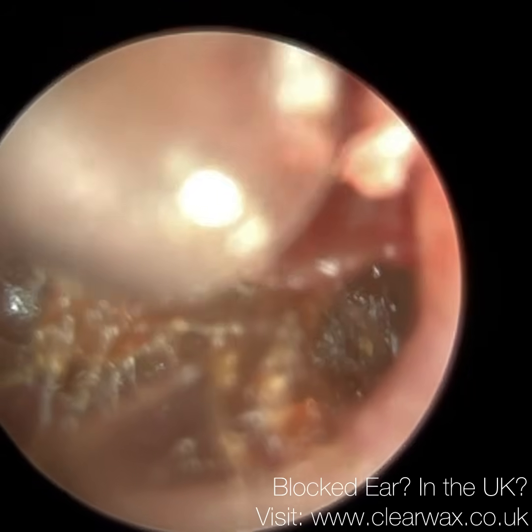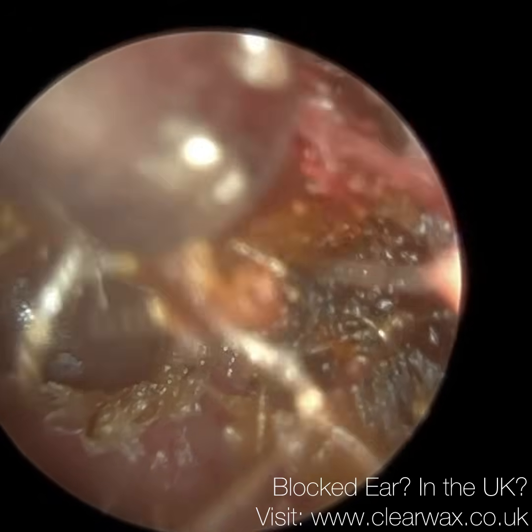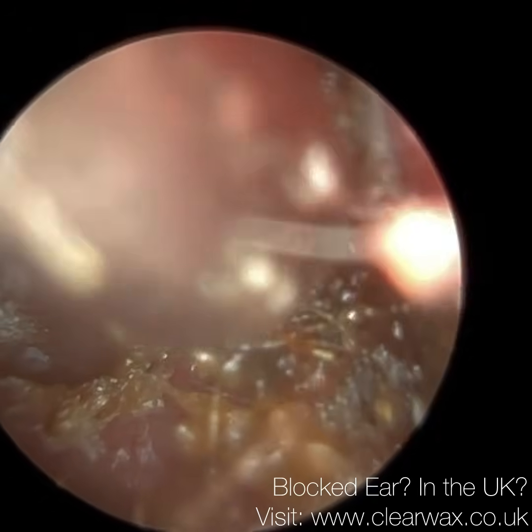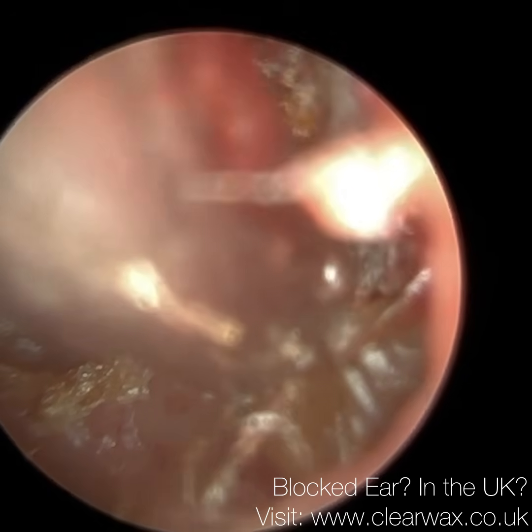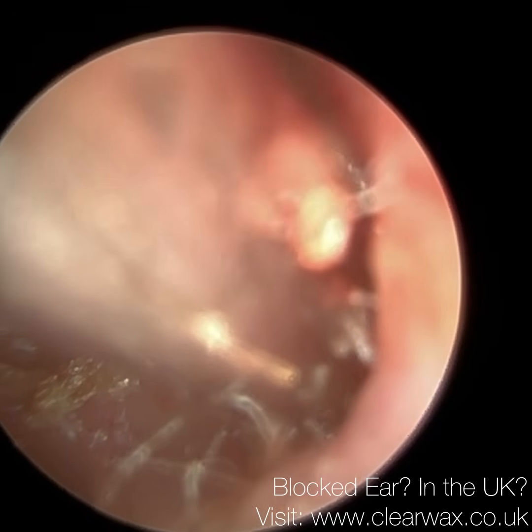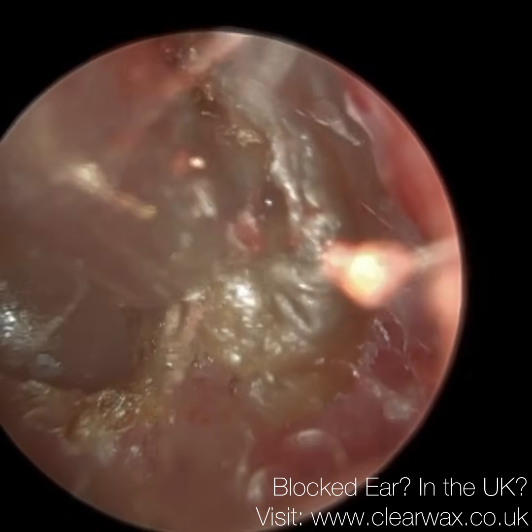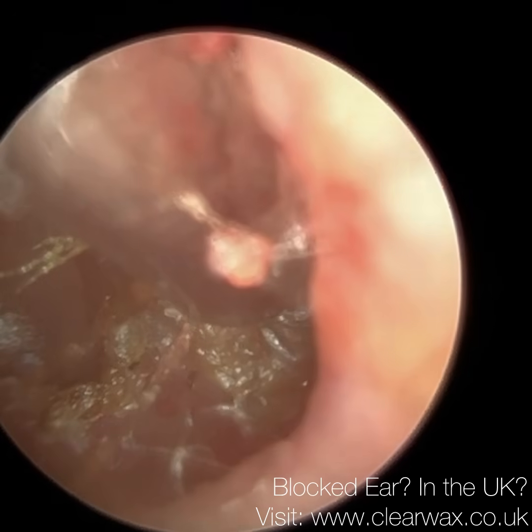But yeah, we've not caused trauma to the ear canal. And in their right ear, which is far easier to clean, you'll see some granulation tissue there as well, which wasn't ruptured. We managed to remove it without rupturing it. You can see I'm really trying to pull this out of the trench.